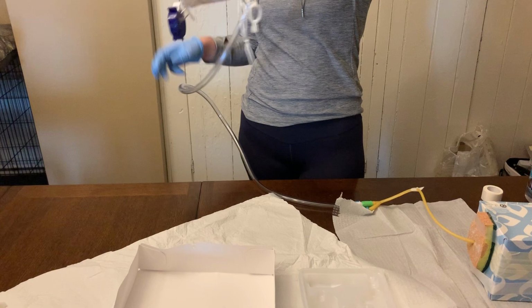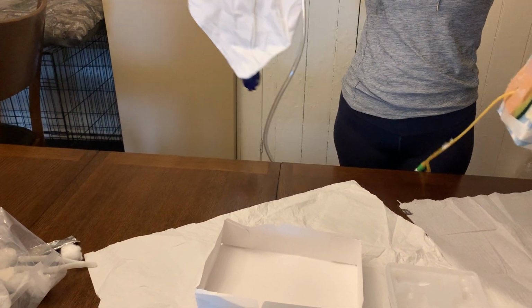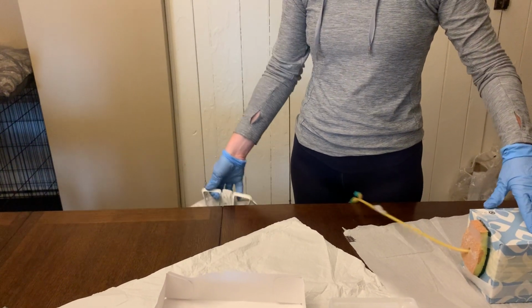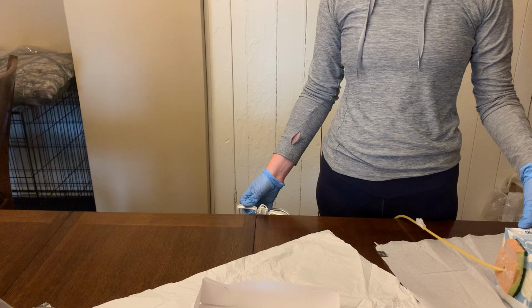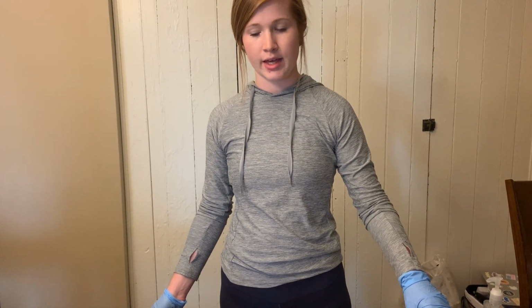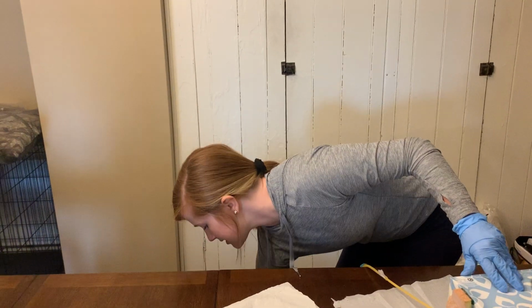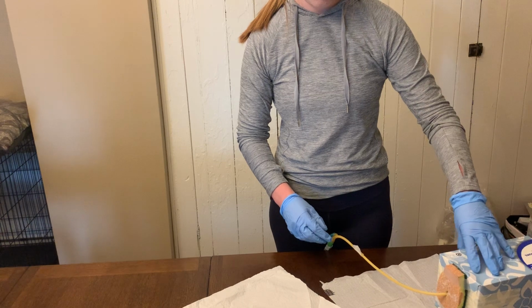I would also take the bag, the collection bag, and my patient likes to run away on me here. I would hook it to a non-movable part of the bed below the bladder level. Make sure there's no kinks or anything in the tubing. I'll set that down here. Okay, and I'm trying to keep this from moving.